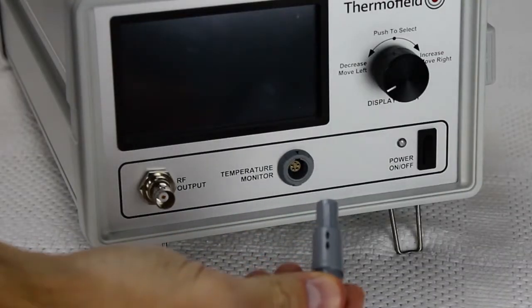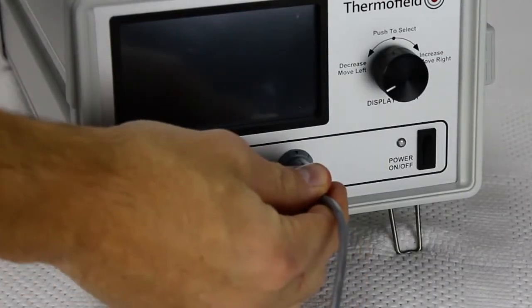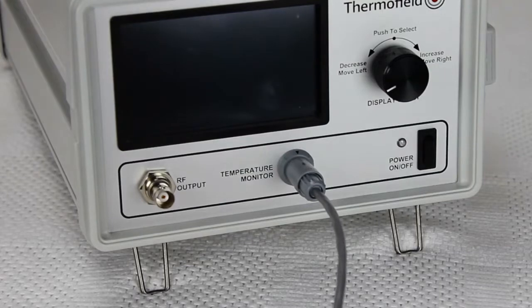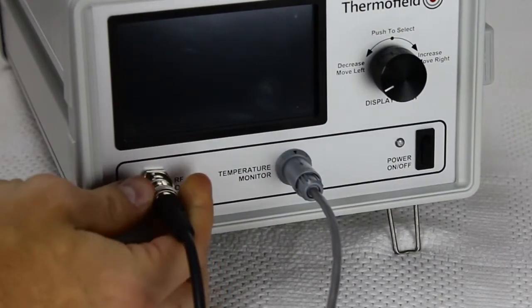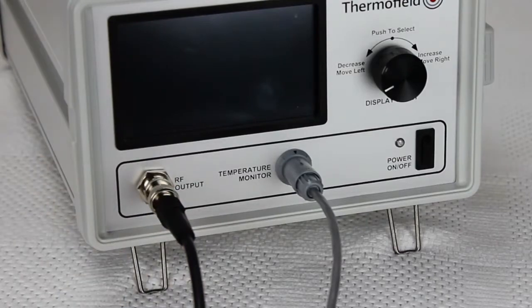Connect the gray cord to the temperature monitor input, lining up the arrows to plug it in correctly. Connect the black cord to the RF output. Twist the tip to snap it into place.